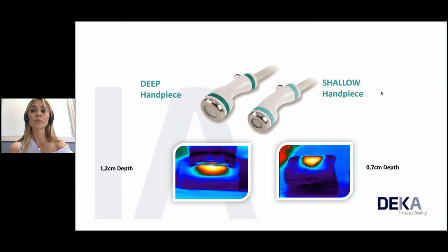For this reason, I want to explain two important points. First, we always have to slide our end-piece on the tissue, because otherwise we could damage it. And second, we have to perform not circular but linear movements, because by making circular movements, we are not able to dampen the temperature in the right way.